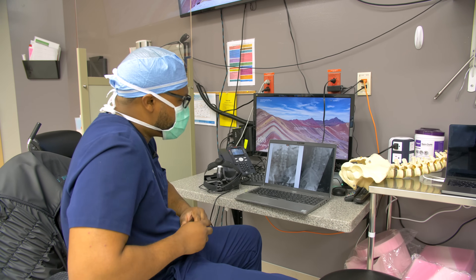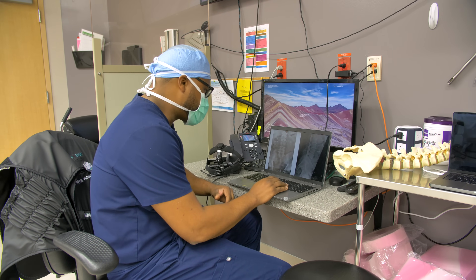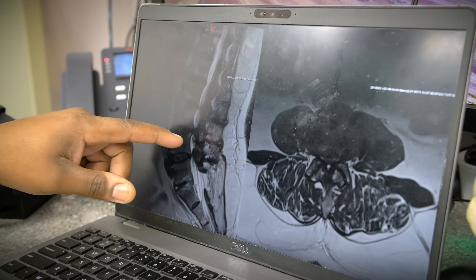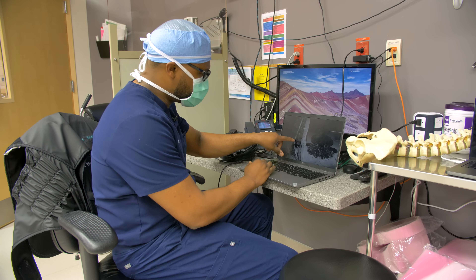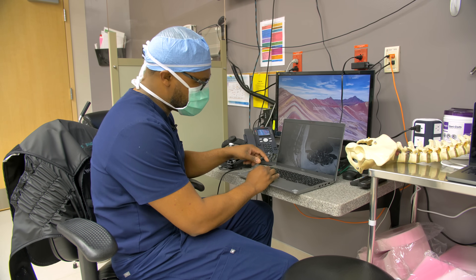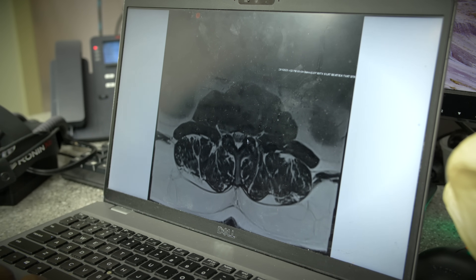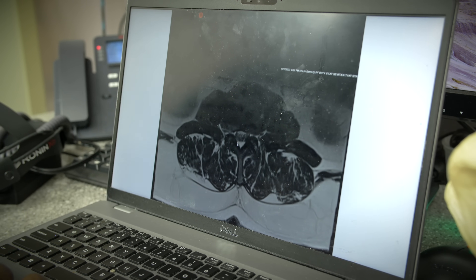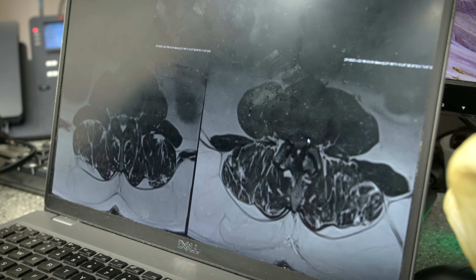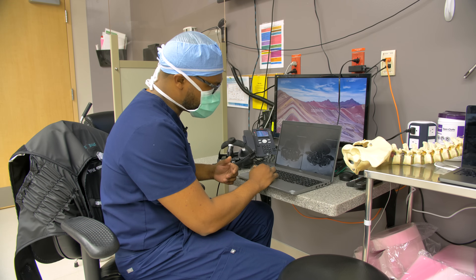This patient has severe spinal stenosis at L3-4, a level in the lumbar spine, with pretty significant arthritis. Looking at his MRI, the spinal canal shows all the white spinal fluid, but when it comes down to this level you can see what looks like a clogged pipe — severe canal stenosis. Compared to a normal MRI where there's ample space for the spinal canal, thecal sac, and nerves, this patient's canal is clearly compressed.